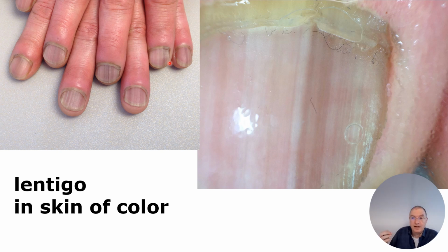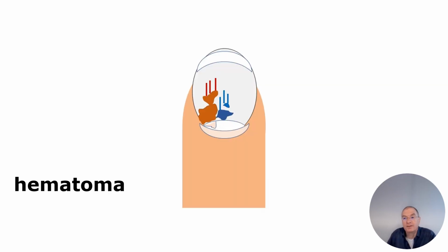skin, or also African skin, so that means I call it skin of color, and we can see this there more often. This is a challenge, because we also have to rule out a possible malignancy in the lentigo. So this is very interesting to see, and then to check it regularly, and when you doubt, you should take an image. This was done from this digit here, you take an image and you compare after 2 to 3 months. But here, at this moment, I do not have any hint for malignancy, so it is fine.